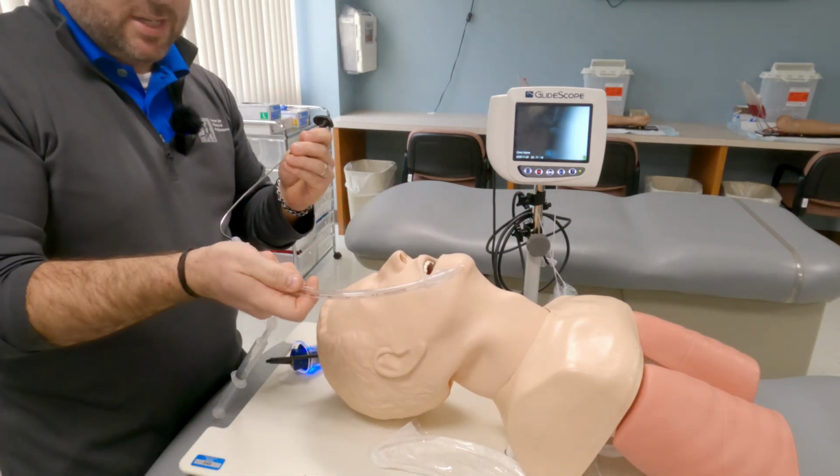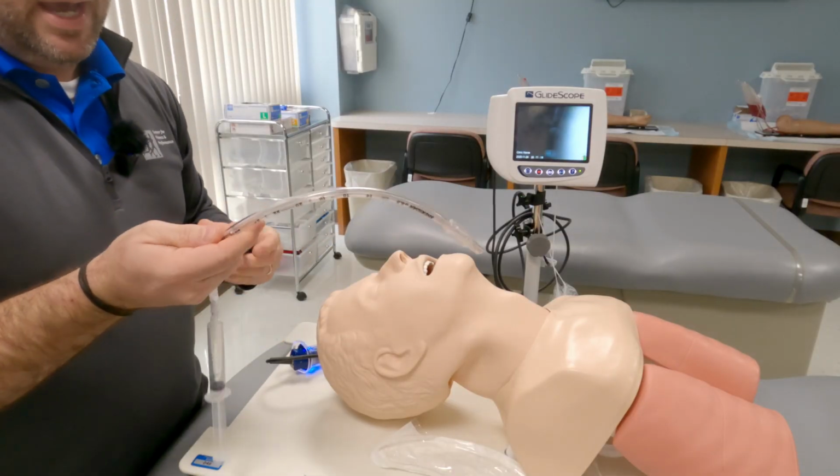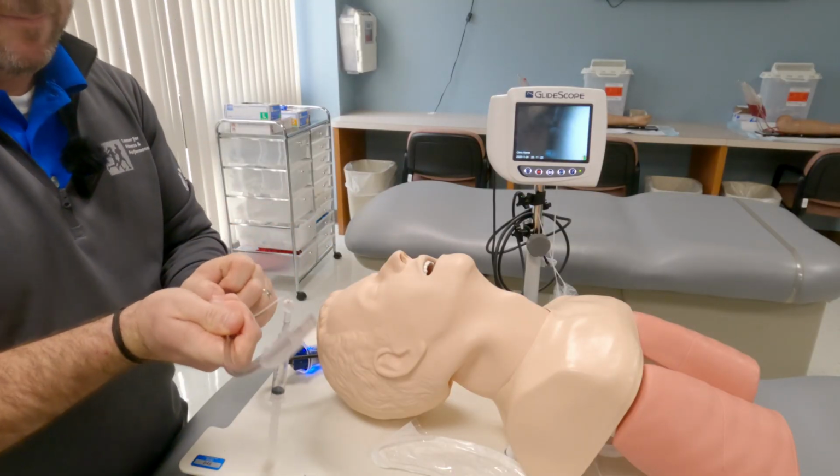Remember, this is a rigid stylet. And let's go over it one more time, how to insert this correctly.